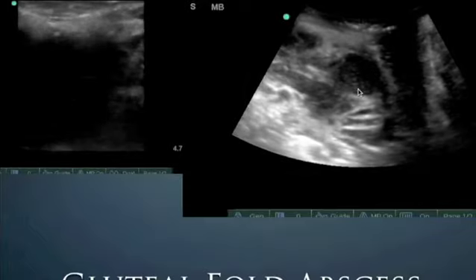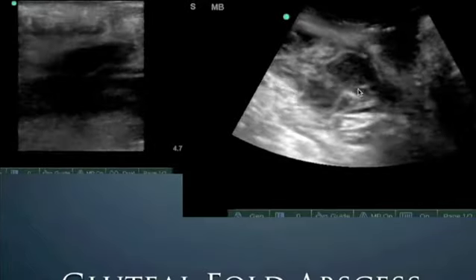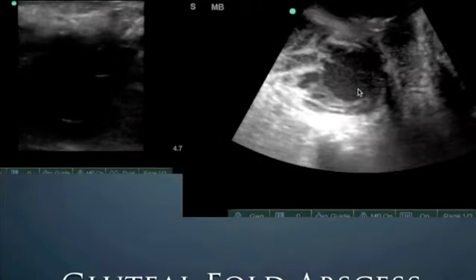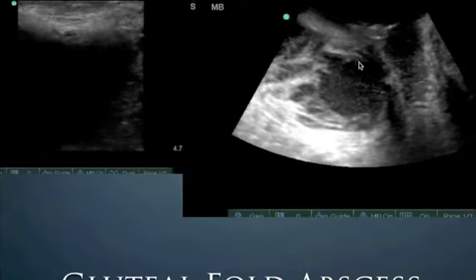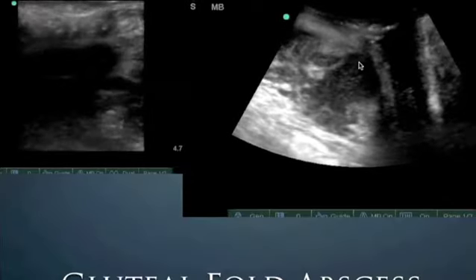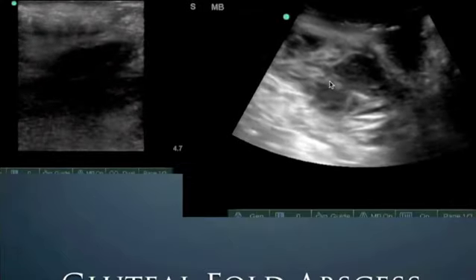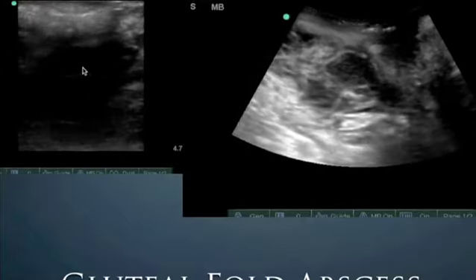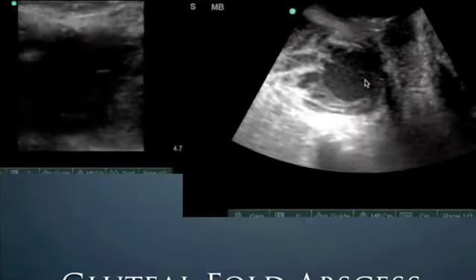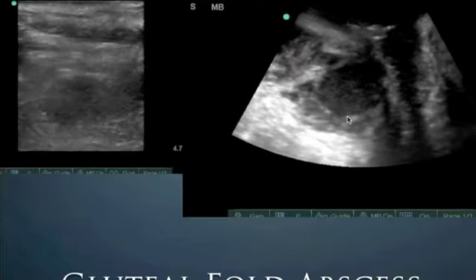There was no overlying erythema. The patient simply complained of pain every time he sits down on his tailbone area, and we weren't thinking much of it because there was no overlying erythema of the skin. However, the guy was very, very tender, so we went ahead and looked first with the linear probe, couldn't see anything. We moved to the C60 in that gluteal fold. That was the thing to do. We could see this large abscess down here that was later confirmed on CT scan.